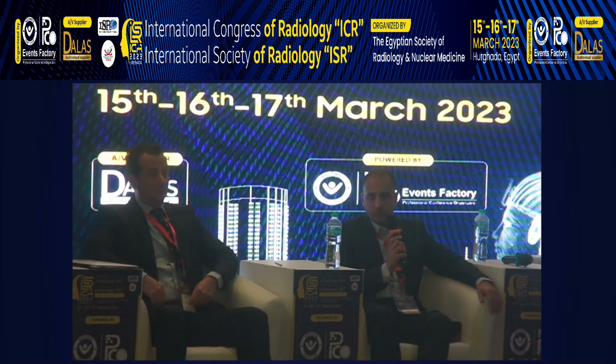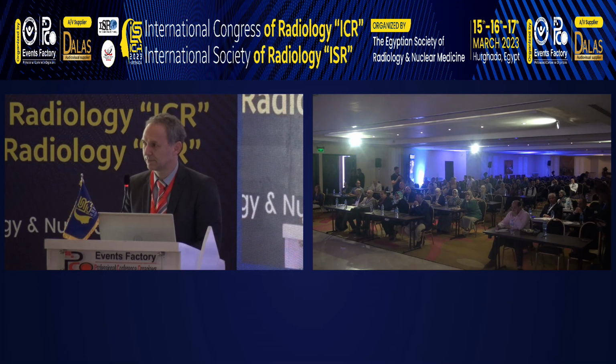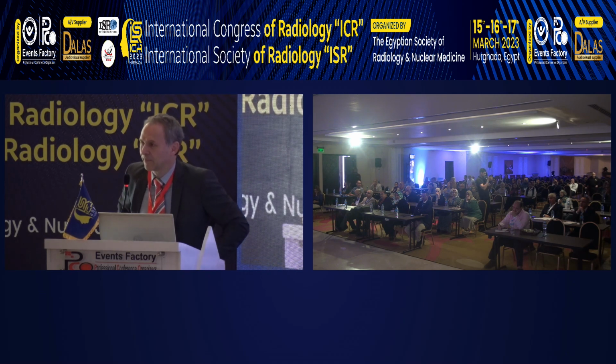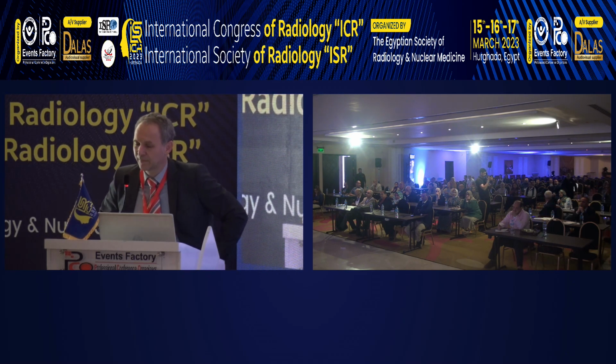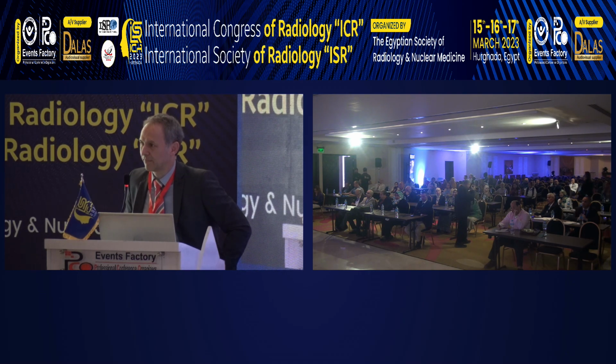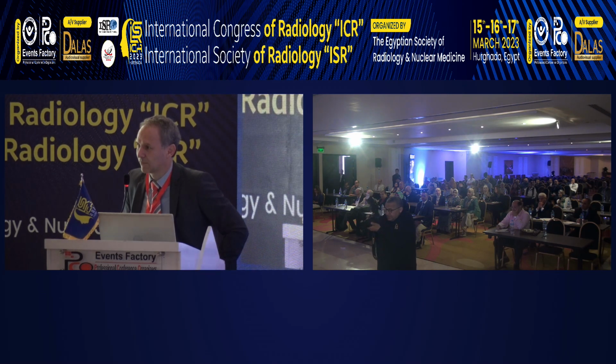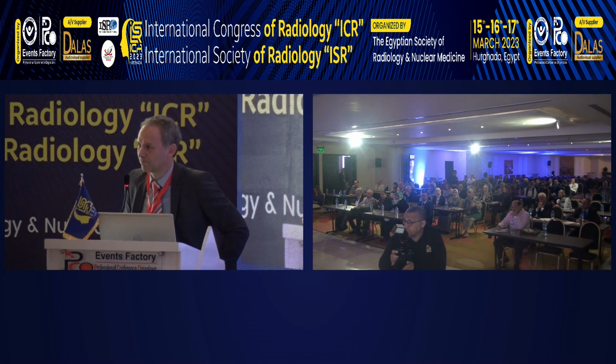Regarding the clinical presentation, usually patients are referred with ankle pain. Sometimes they mention synovitis. And we are puzzled when we see a lot of soft tissue enhancement and fullness within the ankle joint space. In such a scenario, how would you differentiate if the patient is referred for synovitis and you suspect impingement from a radiological point of view, if there is no clinical suspicion of impingement?